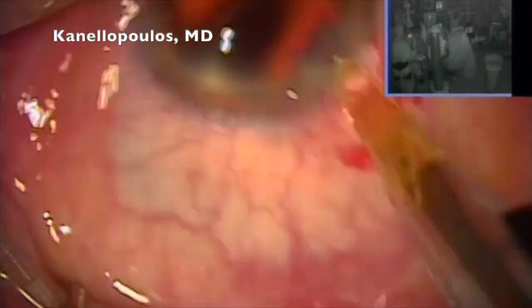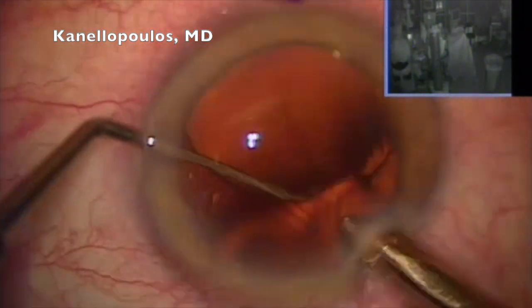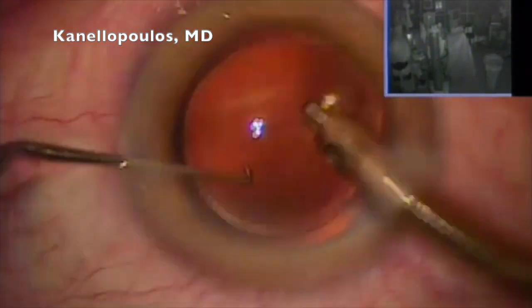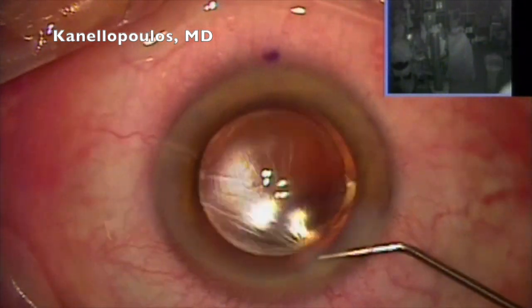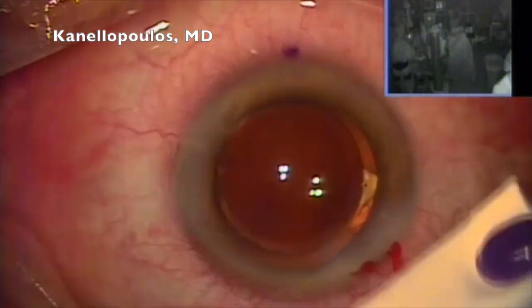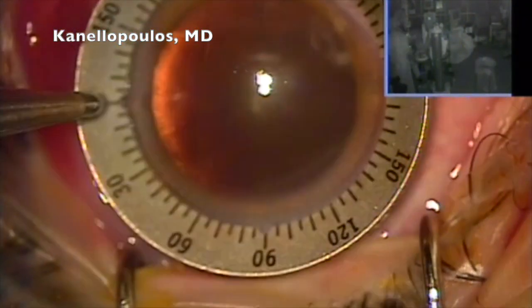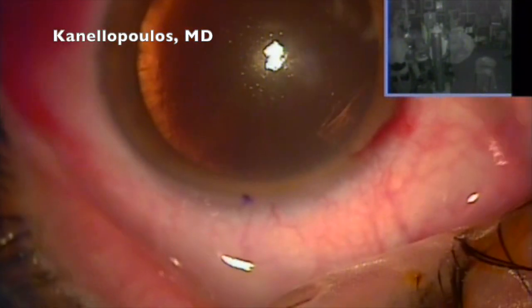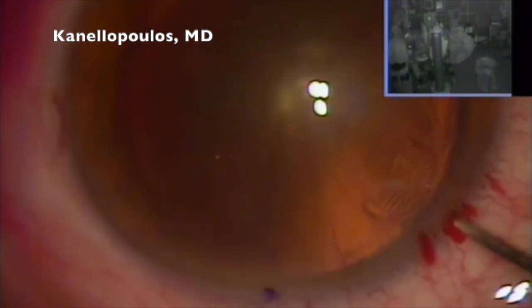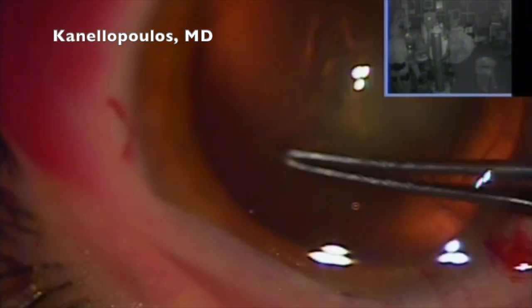Documenting the lens, placing the lens in the bag. I'm right-handed and I operate with my legs under the patient's bed. Thus, this is the ultimate incision site for me for both right eyes and left eyes. We've calculated that it induces 0.3 diopters of astigmatism, so that is incorporated in the IOL calculation. We're going finally in with the lens — with the rule, as we're seeing here. The incision remains at the same spot though. The axis I think was 86 if I remember well.